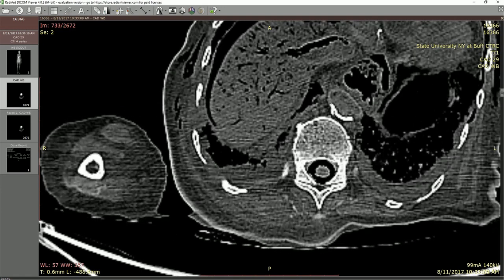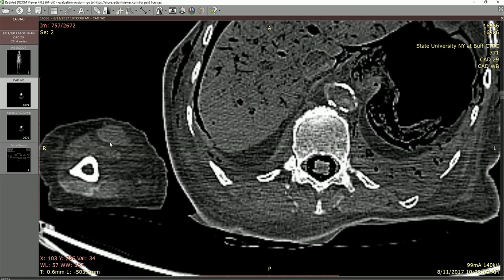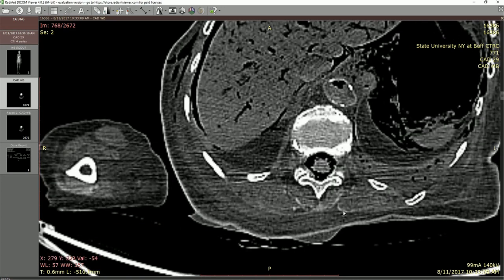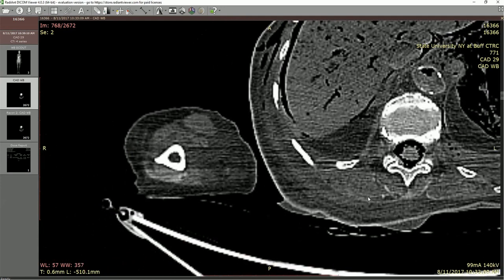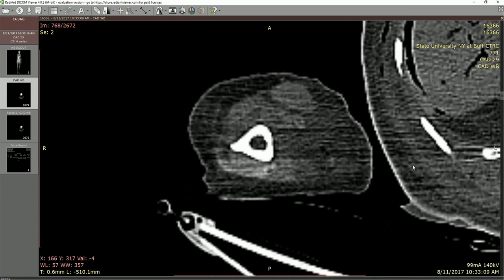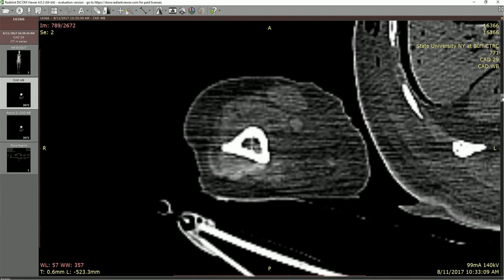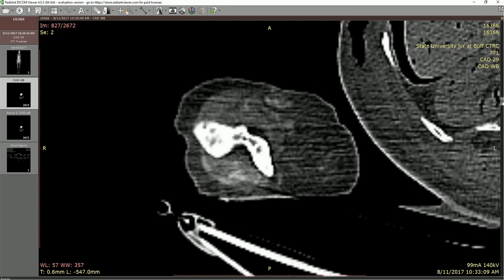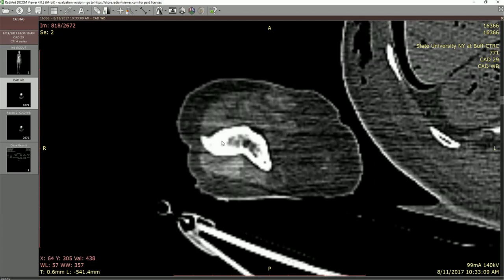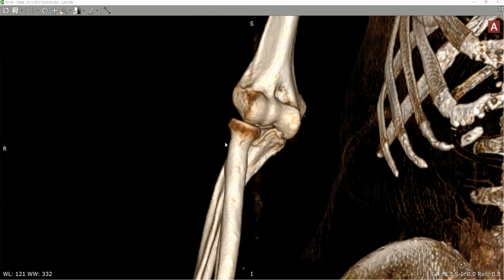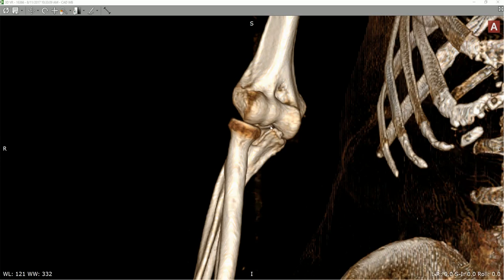Moving down a little bit further, you can continue to see those compartments — probably the outline of the biceps brachii and the brachialis. We're in the lower level of the brachium. Continuing down, we can see the humerus broadening out, so we're probably getting into the epicondyles. It becomes darker because this is the bridge over the bone — from this perspective we have all of this spongy bone, but when we get to this spot it creates a dome of compact bone, which is why the density becomes a lot more dense.